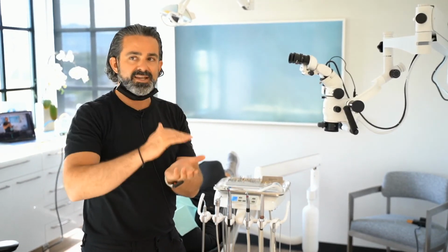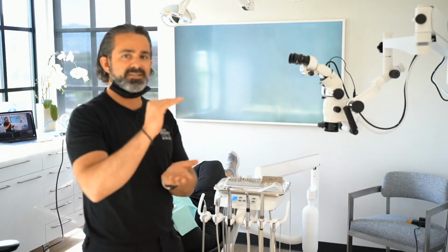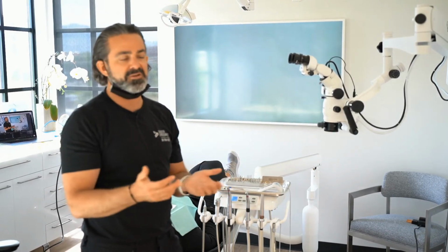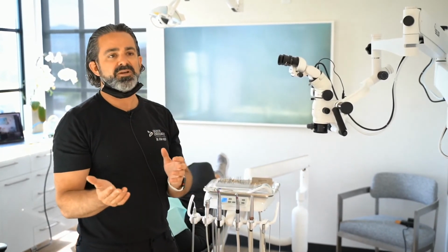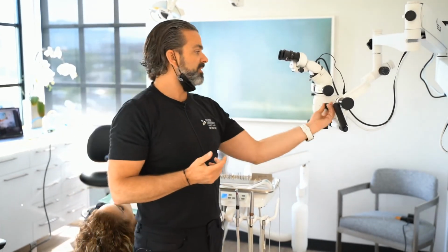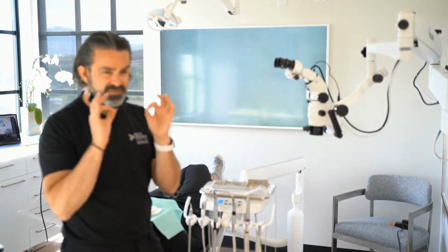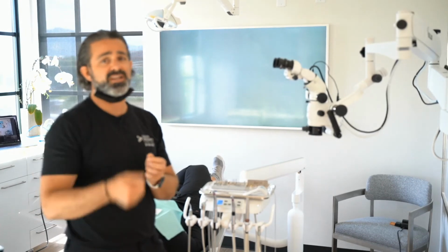But if I need to see the depth, then I'm backing off to like a 3. And so I like that incremental steps because I kind of tailor it for what the job is. Pulpal floor finding high, but if I'm doing a filling, then it's lower. So it's really important to have that. If you're at a 3-step scope where the jumps are really big, then really the talking point is you're just parking it in one lane and staying in that lane, which isn't as fun. The 6 is only if I'm looking at a crack and I have something very, very specific, very, very detailed. And when you're up at a 6, then I'm also cranking the light power all the way up.